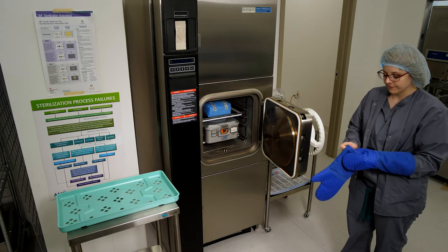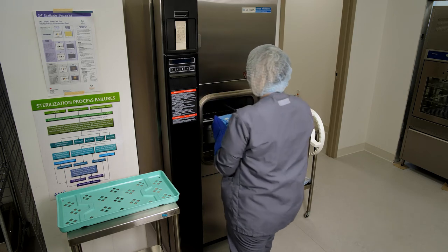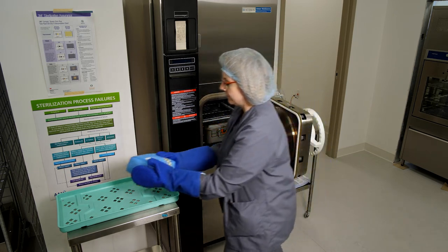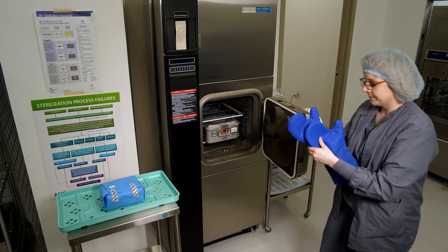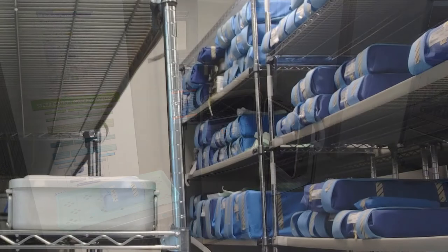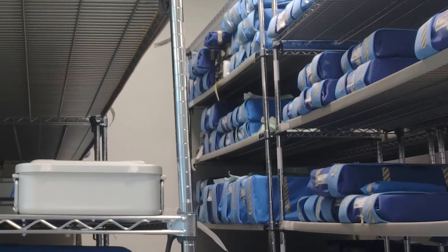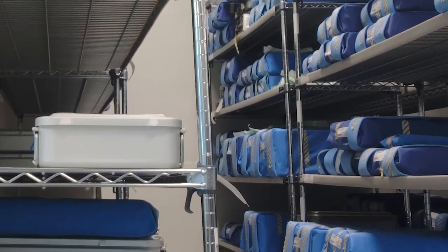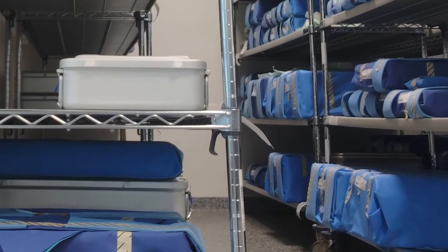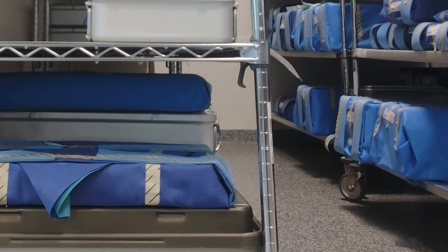Assuring that the sterile barriers do not become compromised is of the utmost importance. Carefully lifting the instruments and placing them in their assigned areas helps to prevent holes, rips, or damage to the sterile barrier. Having a designated spot for each set will also help in locating the sterile instrument when it is requested. The type of shelves used in sterile storage vary, but they all must have solid bottoms to prevent dirt and dust from compromising the sets. They also have to be 8 to 10 inches from the floor and 18 inches from fire sprinklers.